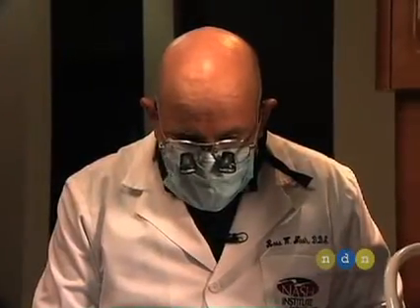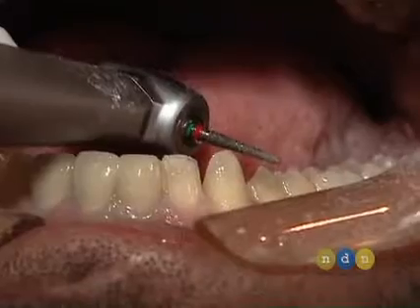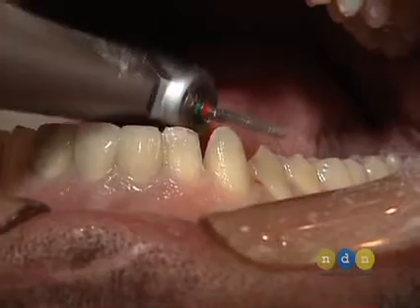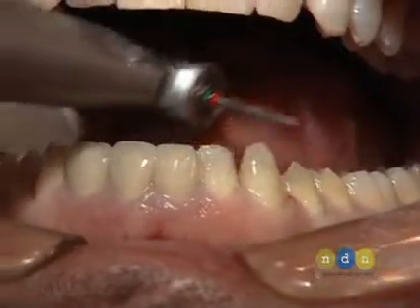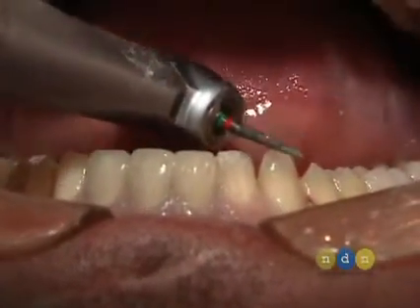Now I'm going to use the base of this burr as a depth cutter, because almost to the base of the burr is a millimeter in diameter, and I'd like to reduce a millimeter over the incisal edge of the canine and lateral to produce enough room for porcelain to go up over onto that incisal edge.